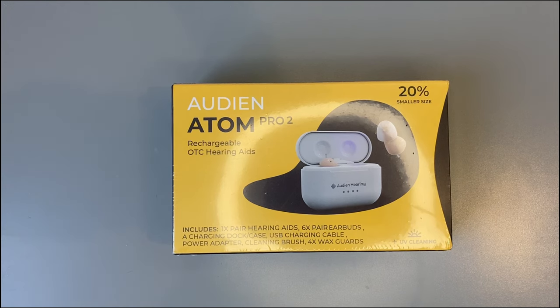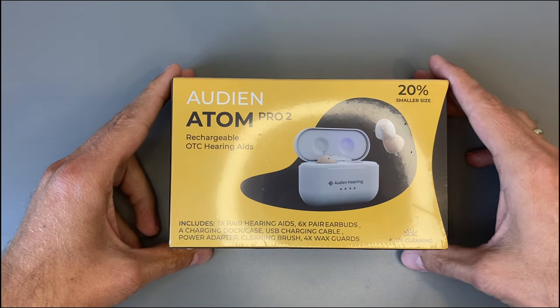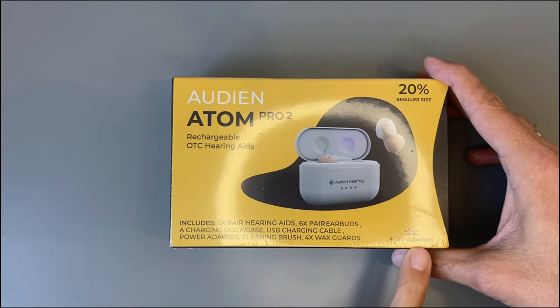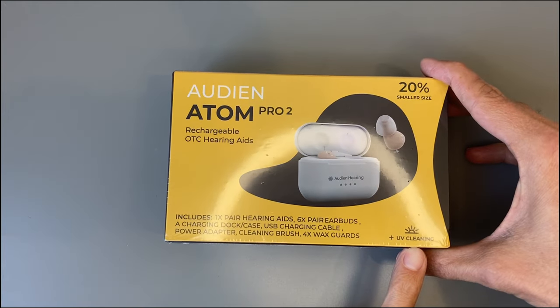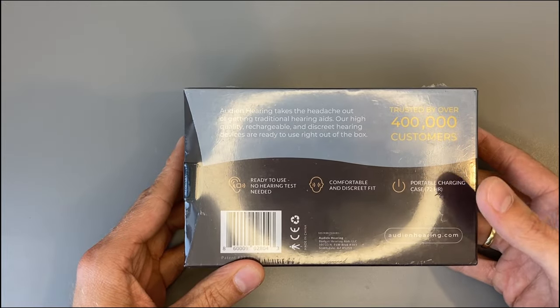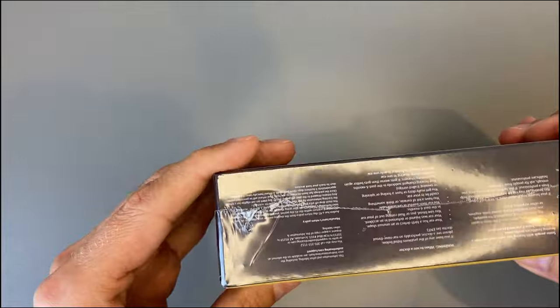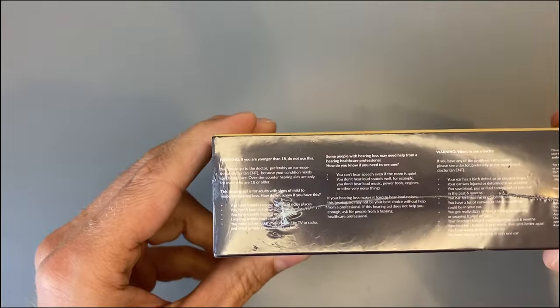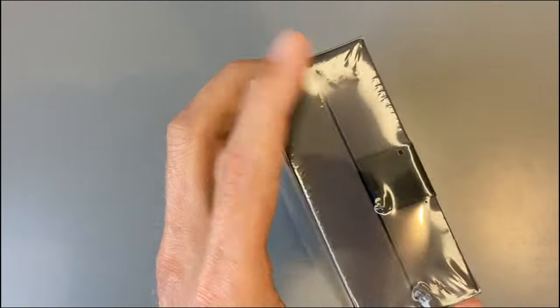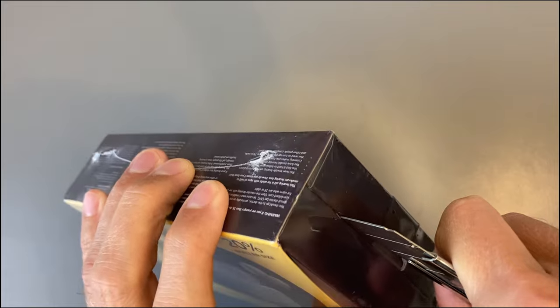The Audien Atom Pro 2 comes in this small box. Included are rechargeable OTC hearing aids plus UV cleaning, which we'll see later. There's also some advertising and the OTC hearing aid warnings — those are mandatory to print on the box.